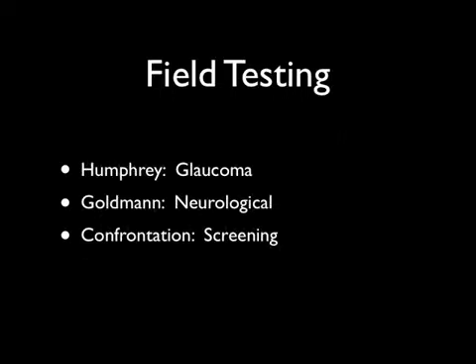Humphrey field testing is routinely used to screen and monitor glaucoma, while Goldmann testing may be used in neurological field defects. Examination to confrontation can be done quickly, so that it need not be missed out of any routine neurological or ophthalmological assessment.